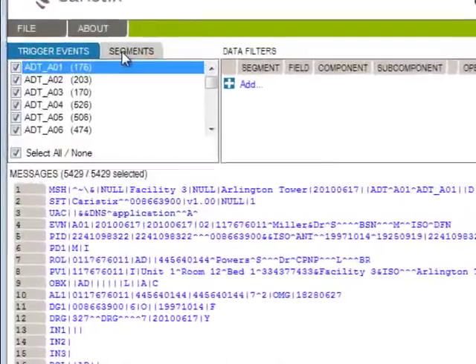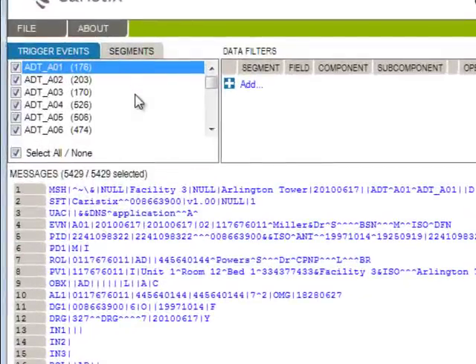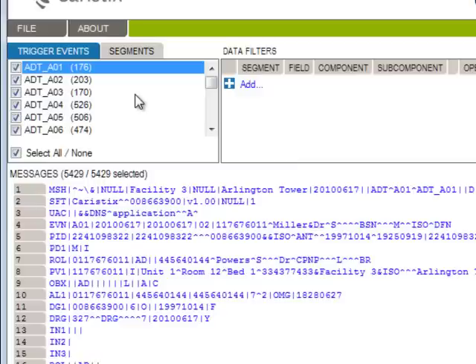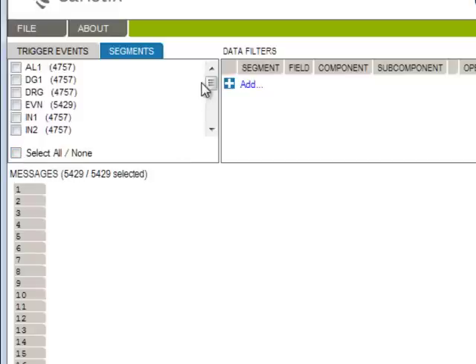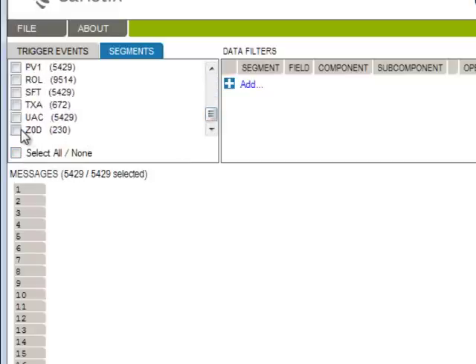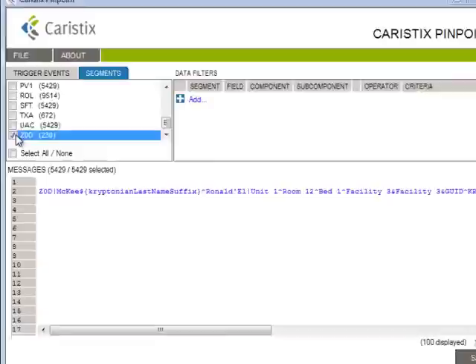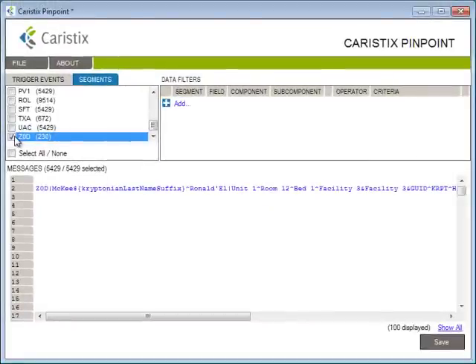Next, let's look at the Z-segments. Here we'd like to understand how this particular provider has set them up in the ADT. And this is useful because Z-segments are the customizable segments that change from one provider to the next. So we'll click on the Segments tab, uncheck All Segments, scroll down, and just select the Z-segment. And there you have it.